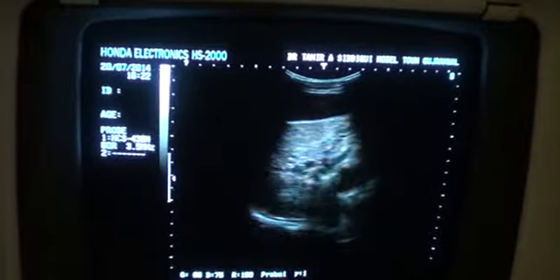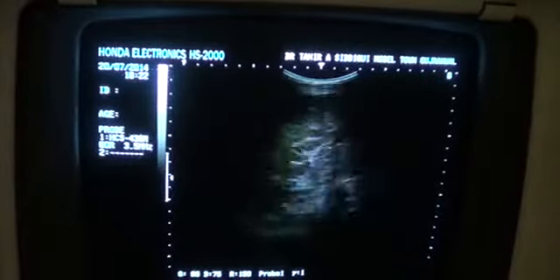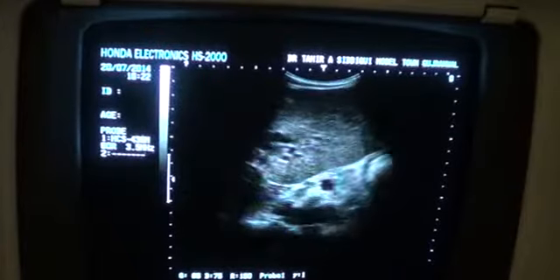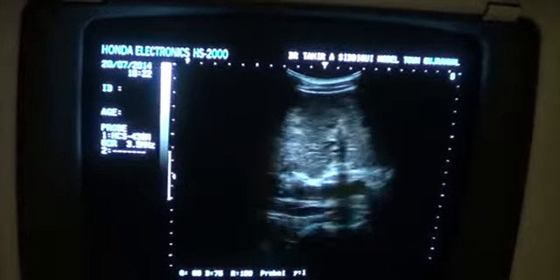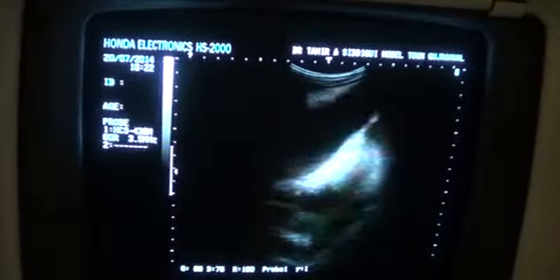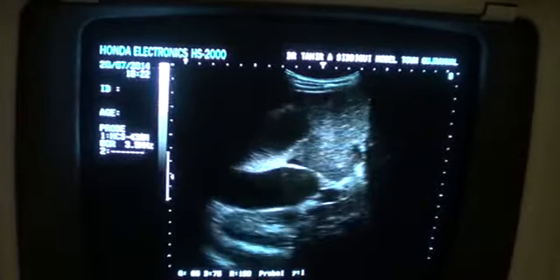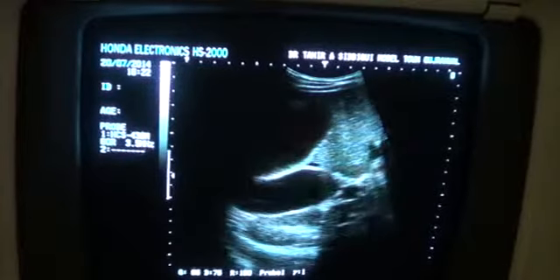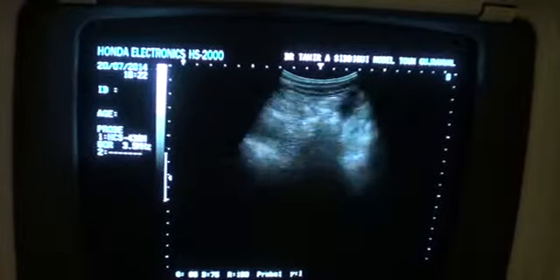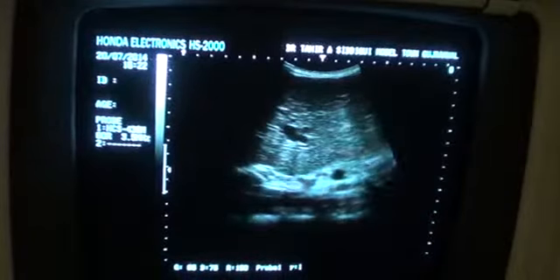So this is our case of the day, which includes a cirrhotic liver with enlarged left lobe of the liver, with a mildly dilated portal vein, which is patent, and we see the dilation of the gallbladder and ascitic fluid surrounding the liver, as well as in the dependent region of the peritoneal cavity in the abdomen, and intrahepatic bile duct obstruction is seen.